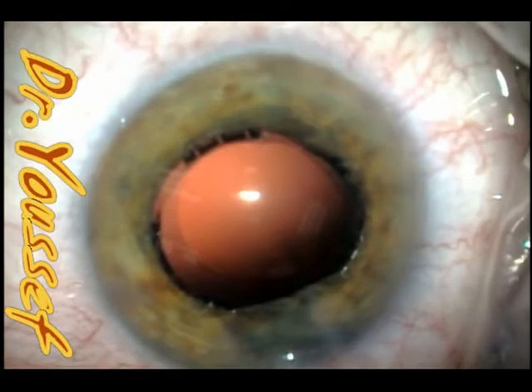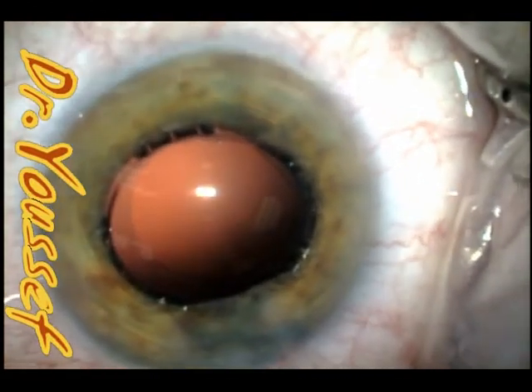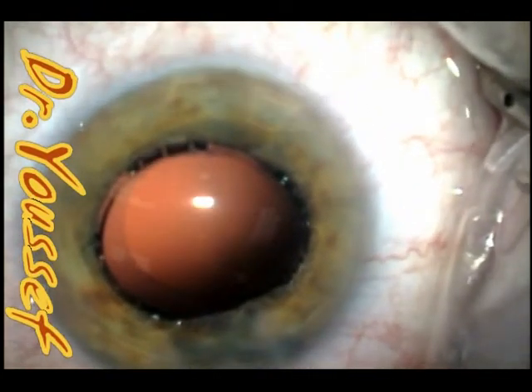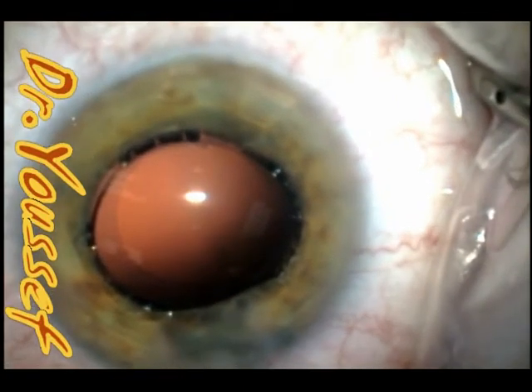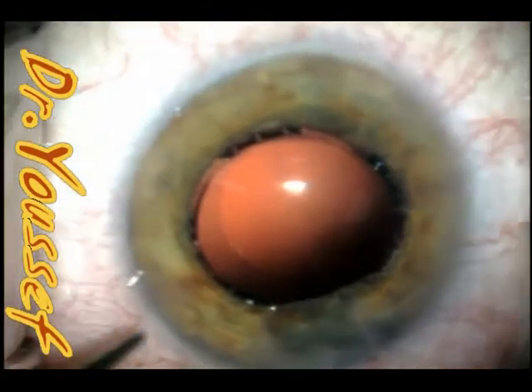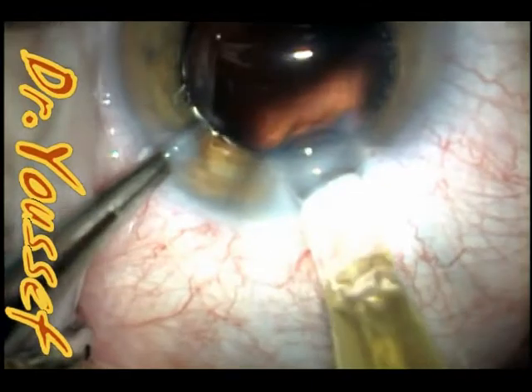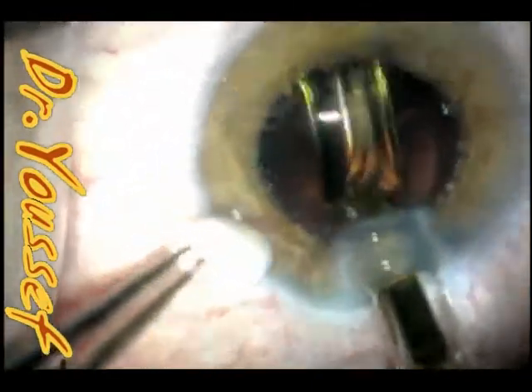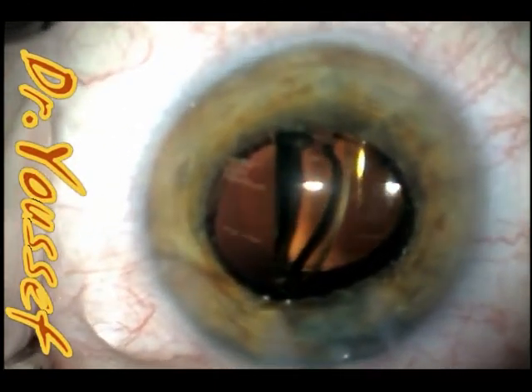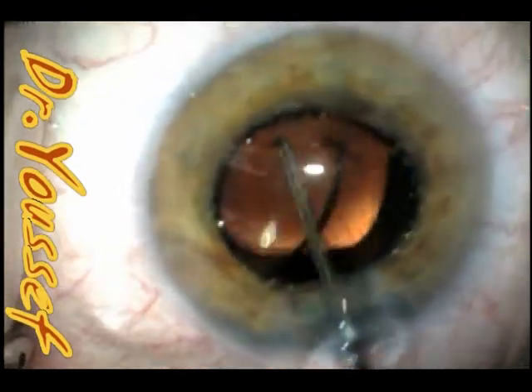As I said, the lens is the SN6080 because of the high power needed to correct her high hyperopia — she's a nanophthalmic patient. When implanting acrylic lenses, I don't go through the wound with the injector; I just place it on the lip so I don't need to widen the wound. This one is about 2.85 millimeters.